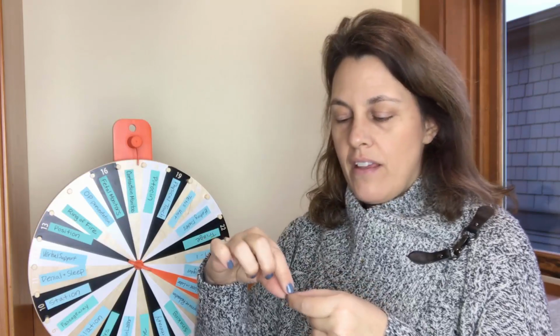There is an internal contraction monitor, and what it looks like is almost like a straw. Your cervix has to be dilated, and it goes up into your cervix and just basically slides around the baby. It doesn't hurt the baby. It's very flexible, very bendable. And it is an internal pressure catheter, and it is more accurate as far as the intensity of the contractions because it's inside your uterus. So it really can more accurately give an idea of how strong the contractions are.